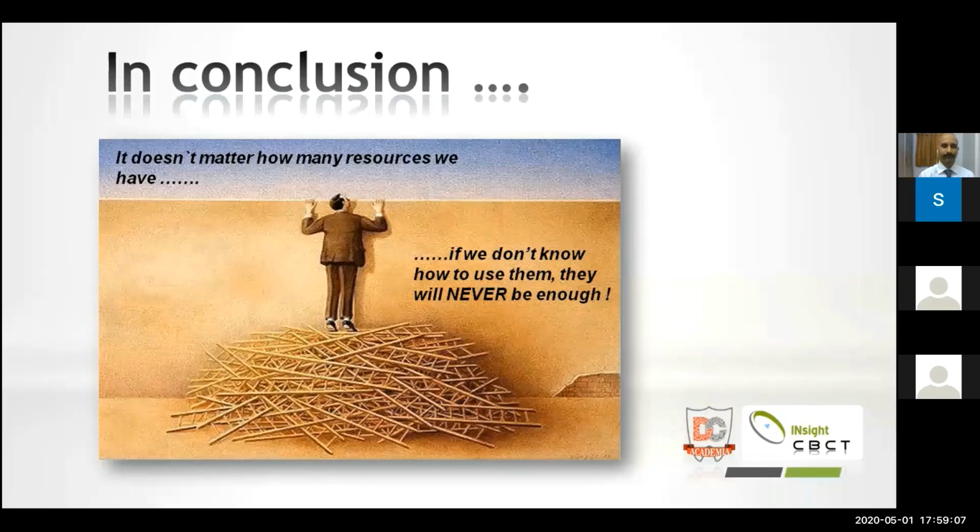And as we grew, we realized that all these technologies are really playing a big role in fine-tuning our workflow. So after the freehand placement and all that, we could really look into these technologies to make work much, much simpler, easier, and less of a stress on yourself while you start with a case.